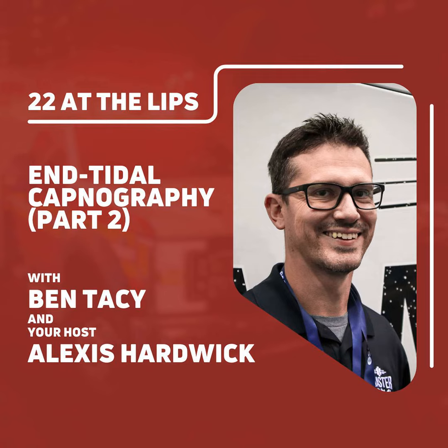Yeah, and I think it's important to know how it's working and what the numbers mean for when you think it's not working, for troubleshooting it. So some of the big things that you can see, and you brought it up in pediatrics, is if the child's so small you're using an uncuffed tube, which, the things have changed saying that hey, you can use cuffed tubes on everybody.